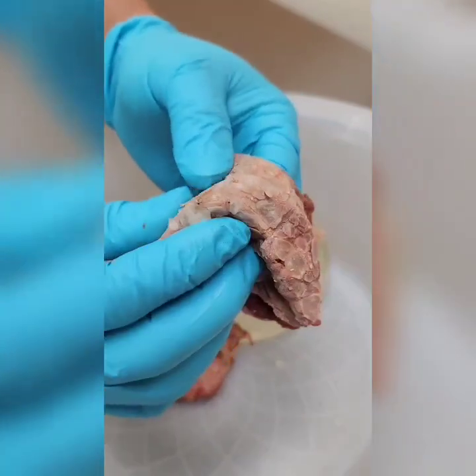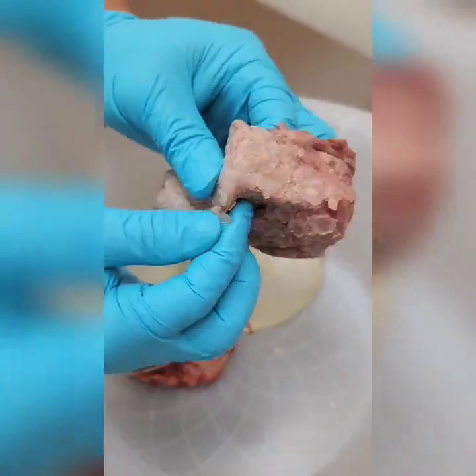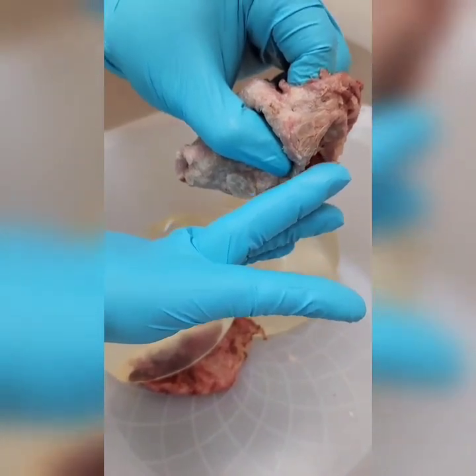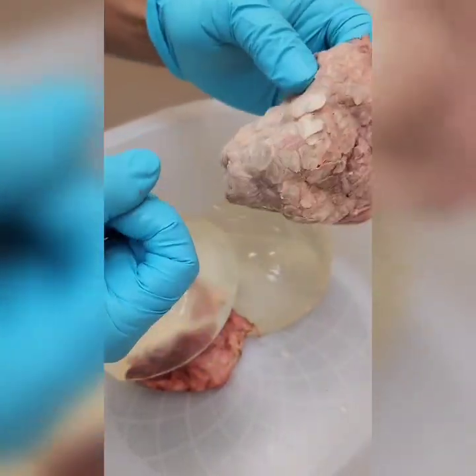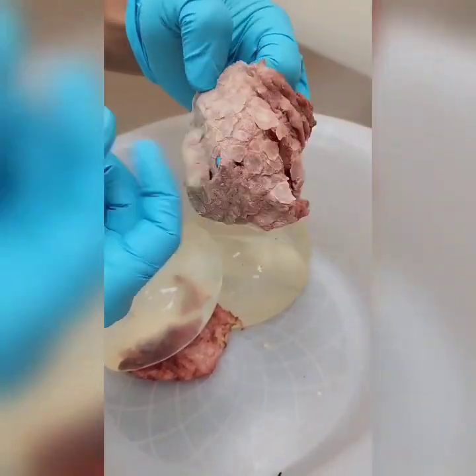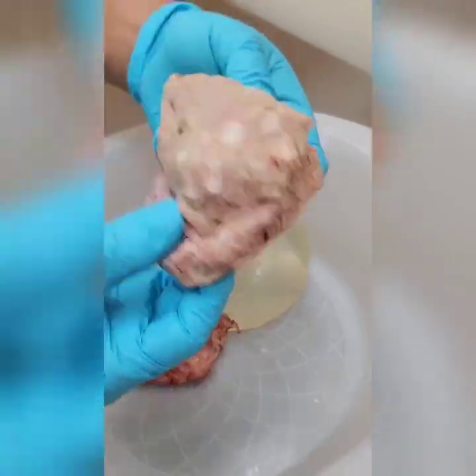So this will cause pain, discomfort, especially if one of these edges happens to be pushing on the breast from the inside. It's really sharp, and you can hear how hard it is. It's like an eggshell. Okay, so that's one.